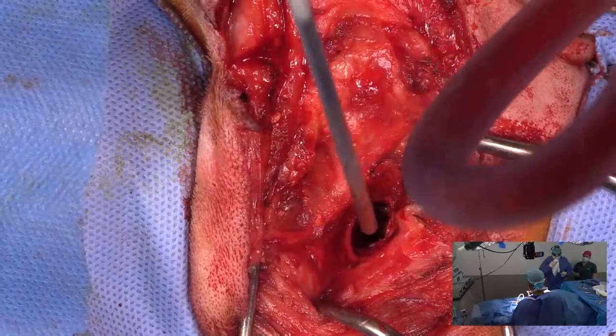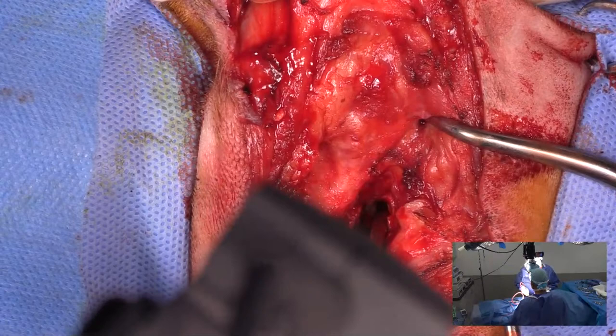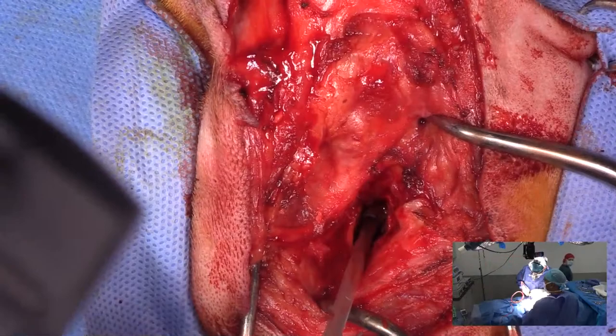My loops are going to let me have a really good look down into the bulla, and it hopefully is going to increase the lighting for you guys to see as well. So can you guys see the white at the bottom of the bulla there? Can you guys see that white? Yeah. So when I look down here, you guys can see white down there? Yeah. Okay.